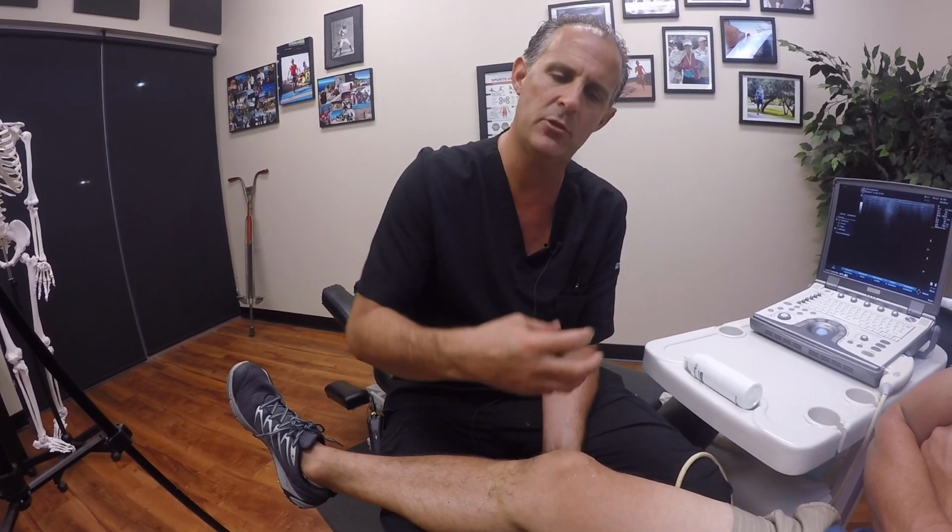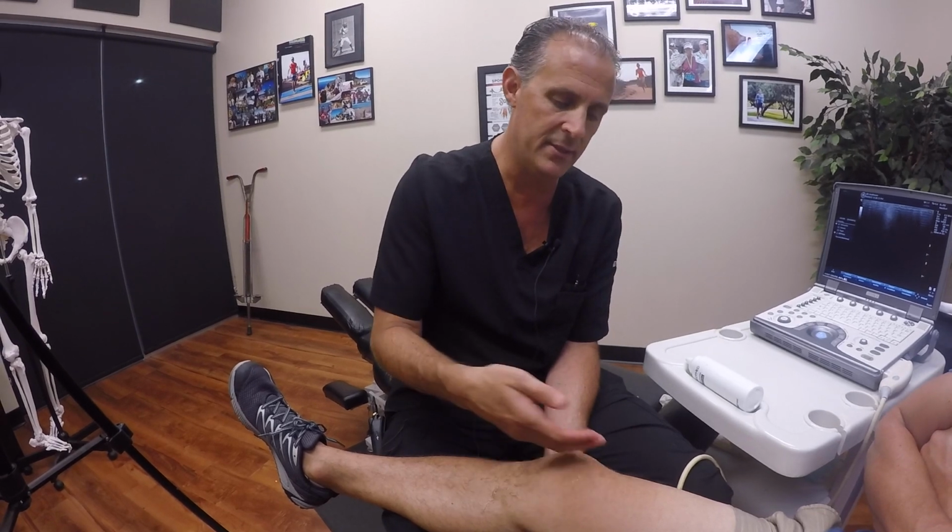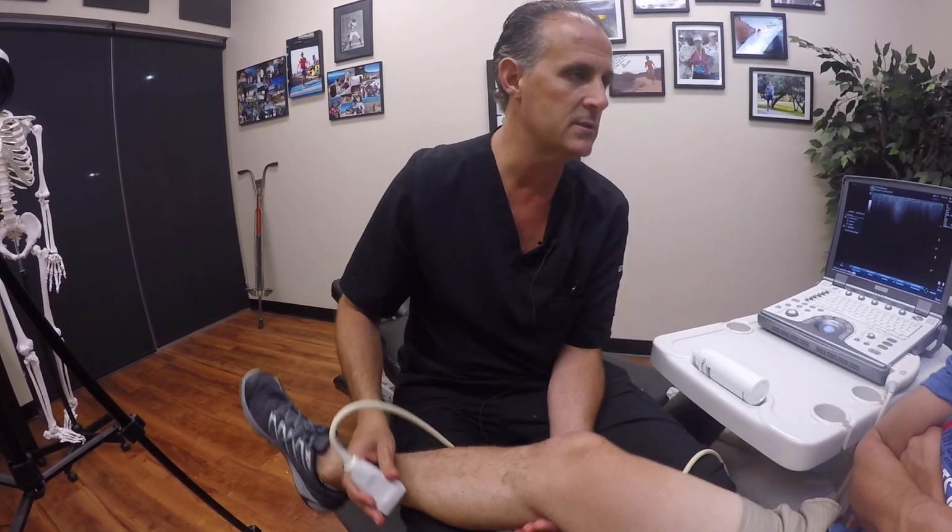And this might be the most beneficial thing for people watching this that have knee pain: the most common thing that we see is a syndrome called patellofemoral syndrome. Patellofemoral syndrome is when the cartilage behind the kneecap wears down and starts to thin out, and the spacing between the kneecap and the femur underneath diminishes. As that space diminishes, you start to get some friction between the two structures, and that friction creates pain, it creates fluid, and that might be the other culprit for this fluid up in here. There's probably some patellofemoral issues going on. So we'll have to take a look into that.